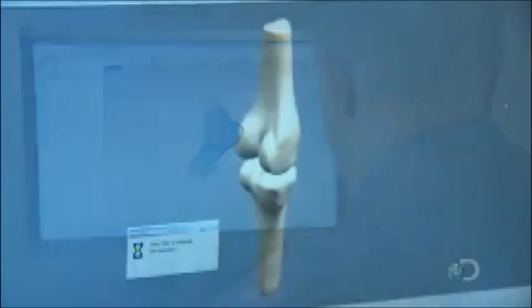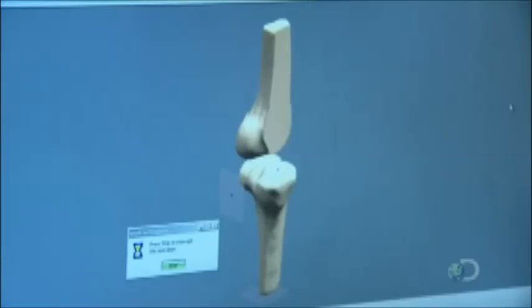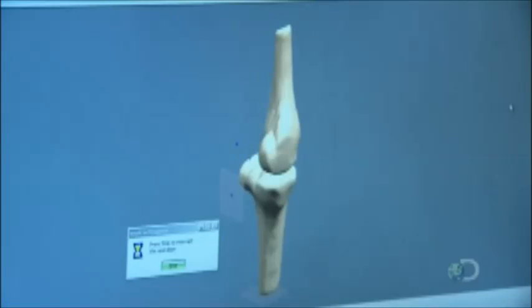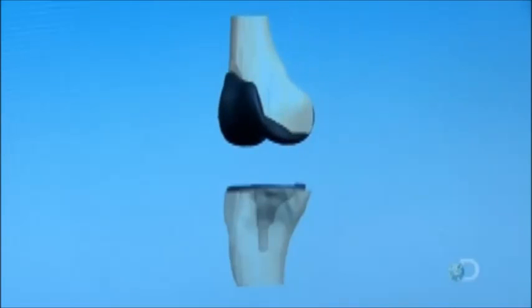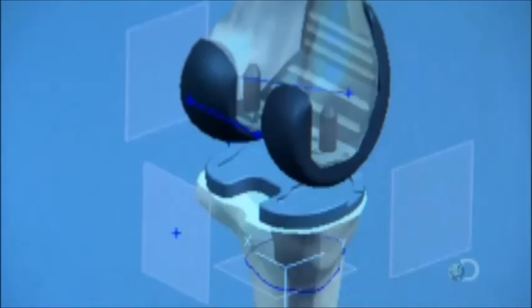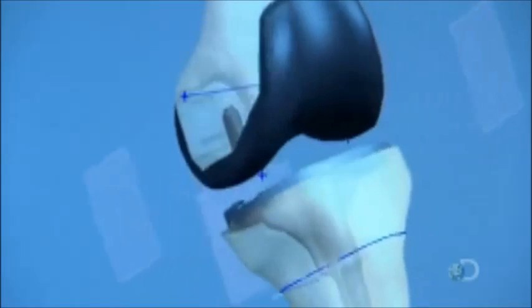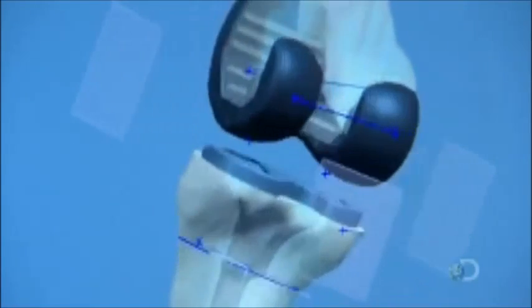Once each bone model is ready, another engineer applies a 3D model of the correct size implant. Then, following directions the surgeon has provided, performs virtual surgery on the bone model to properly align the implant to the patient's specific anatomy and fit it to the angle at which that particular knee moves.